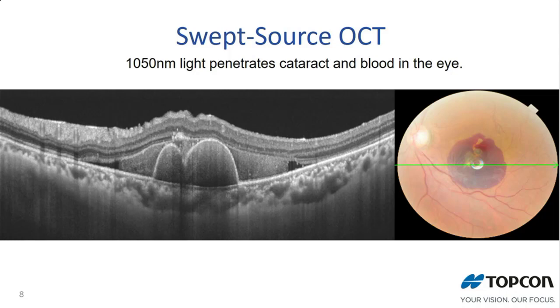And here we see then the direct benefit of using the OCT in this manner, because here we have a subretinal hemorrhaging, and you can see the light is able to pass through the hemorrhaging, through the RPE, through the choroid, all the way down to the sclera. And the need to be able to see the choroid is going to become more and more important as time goes on, especially for the reading centers, by the way, where it's going to become very relevant to you guys.